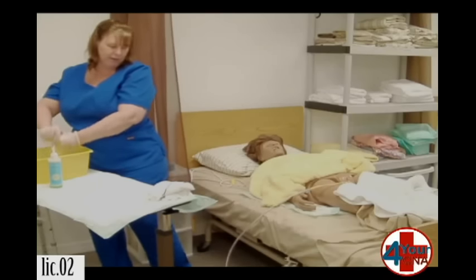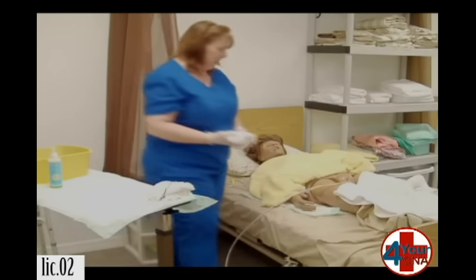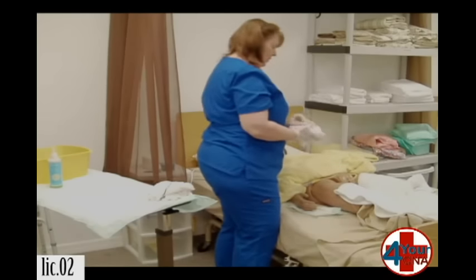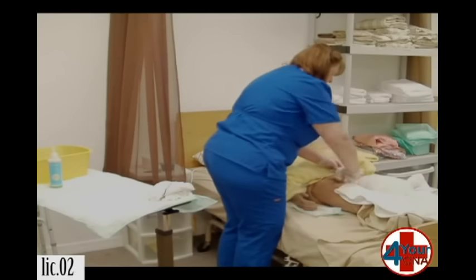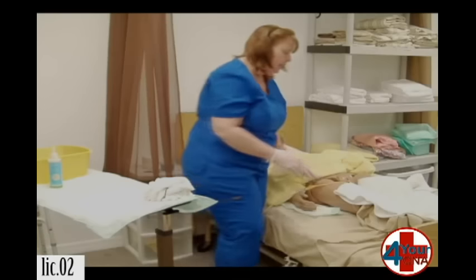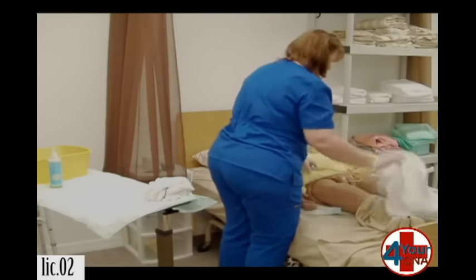Almost done. One final rinse. We're going to repeat the process. I'm going to hold the catheter up out of the way, open you up, and go once right down the middle. Outside. The outside. Skin fold. And skin fold. Set that aside. I'm going to take a corner of the towel and dry you off from top to bottom. Once I reach bottom, it will come out.